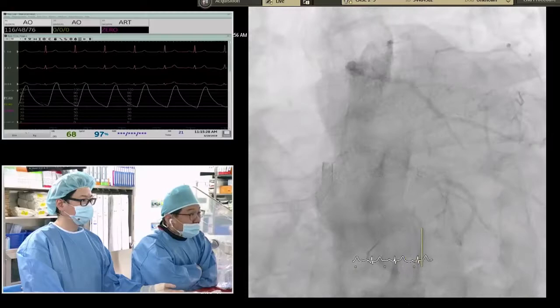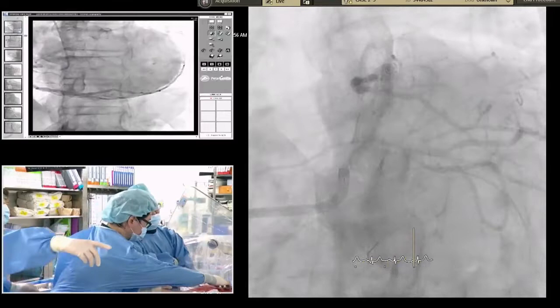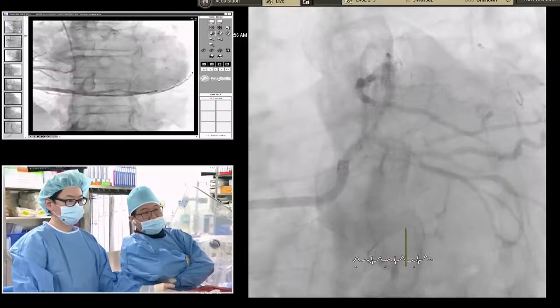No, I think the stent is just the LAD. There's not a stent across the left main, right? No, not supposed to. Yeah, I would FFR the circ myself if you can. You can see the RCA. RCA looks fine. Yes.